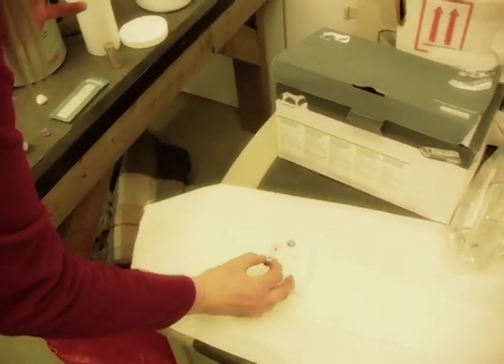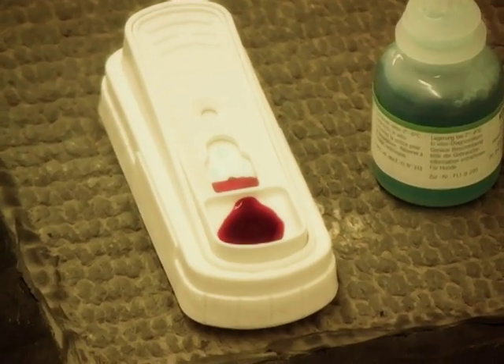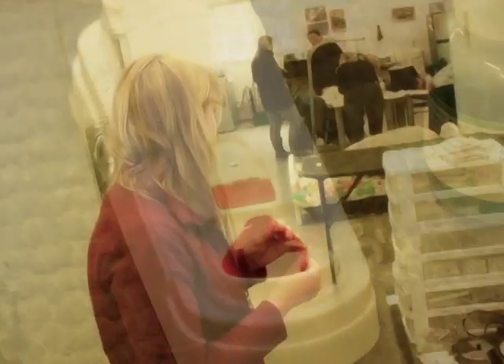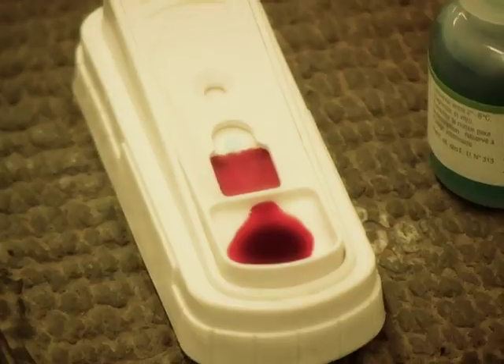Then what you want to do — this is your test here. You want to fill the well with your sample. It takes a couple of minutes; you can see the blood working its way up the paper.